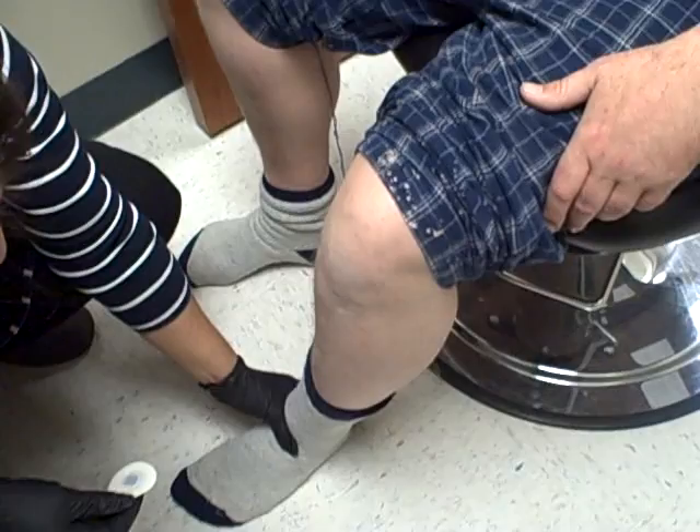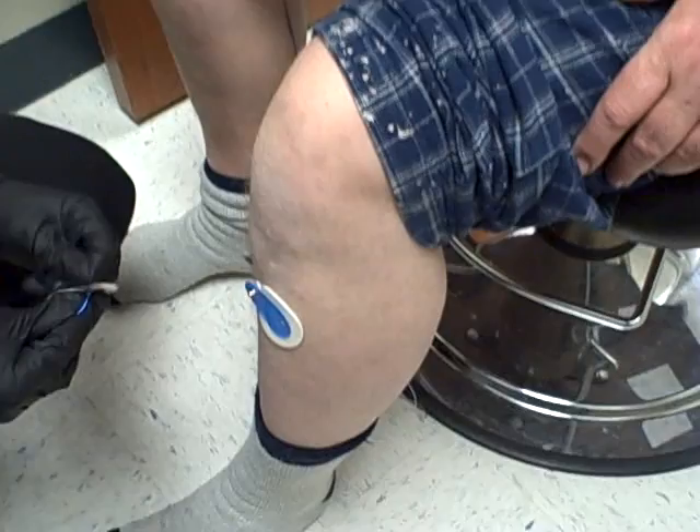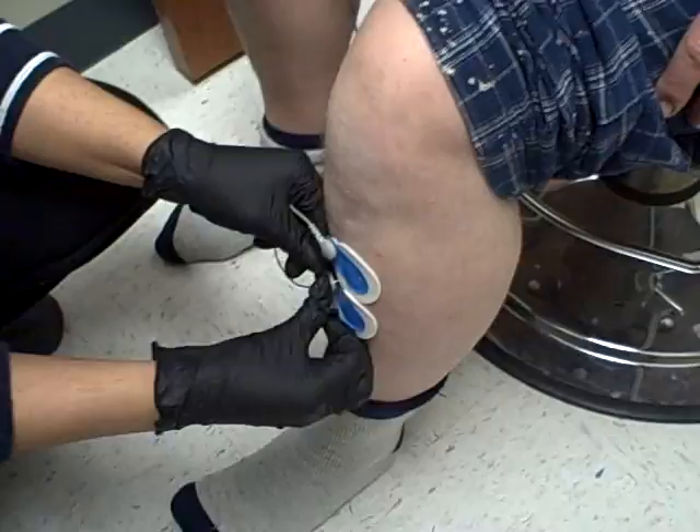Then make sure you have proper placement for the legs. Ask the patient to keep their heel on the ground and have them pull their toes up off the floor. If you notice, this muscle right here flexes out — so this is the proper positioning for the leg leads. Here are the leg leads that we previously threaded down the patient's clothing, and you just snap those on and they're all set to go.